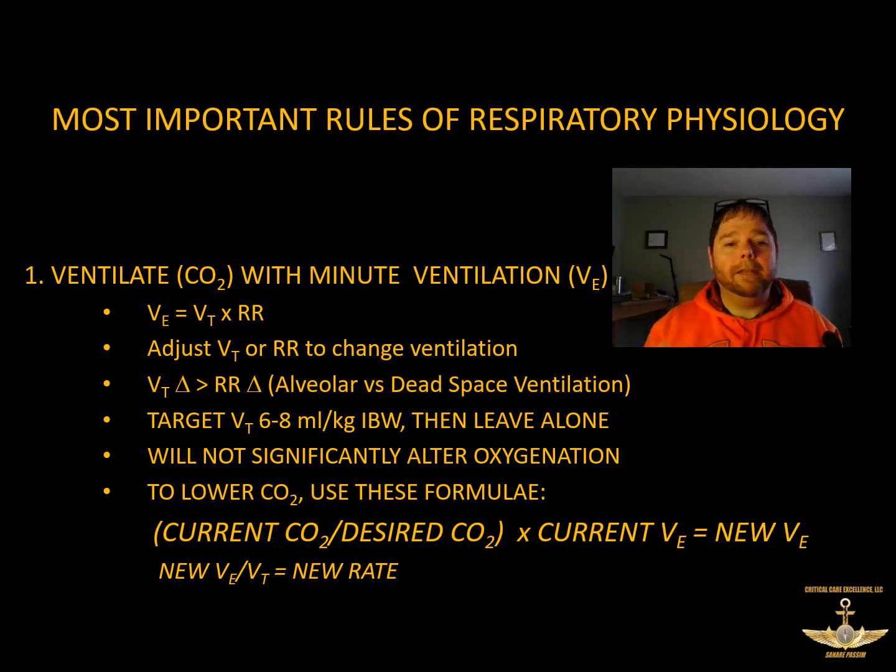So, if you want to target how much CO2 you want to move and what you want to get your CO2 down to, then you can use these 2 formulas. So the first one you see there is your current CO2, whether that's your end-tidal CO2 or your PCO2. This formula is designed to work for PCO2, but if your end-tidal CO2 is high, this will also help you.